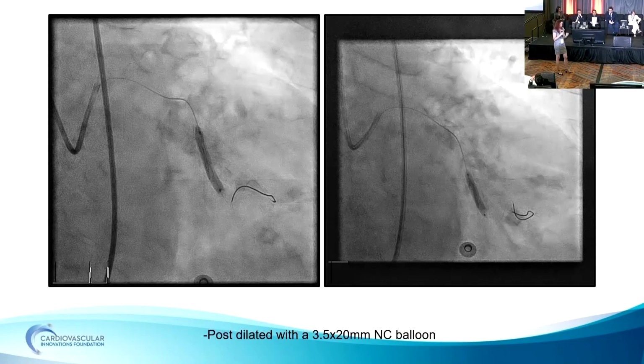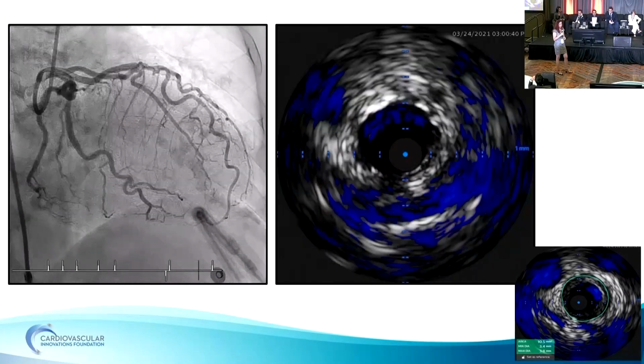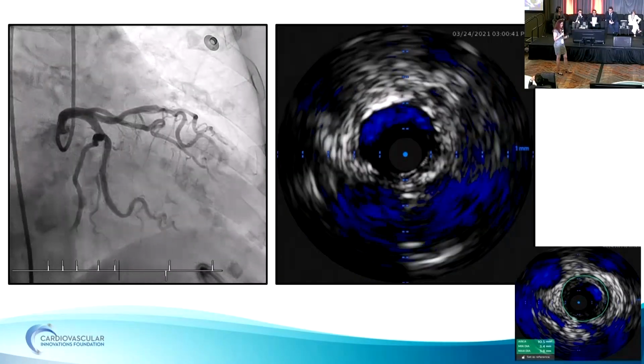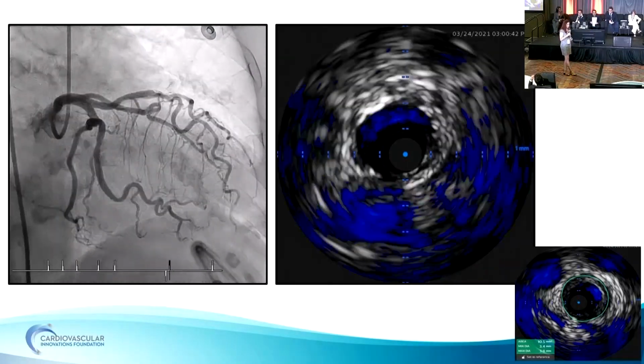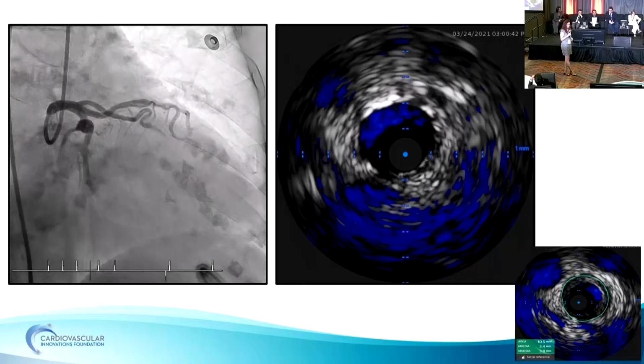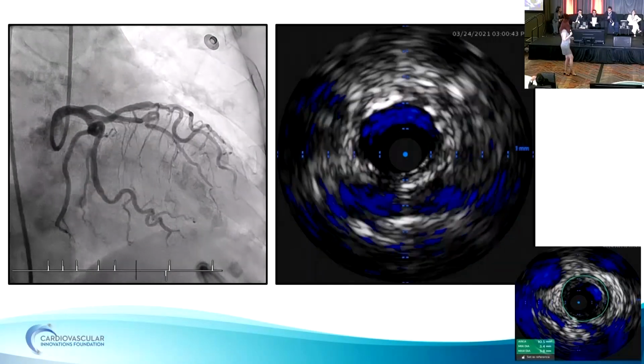You can see that portion of the vessel is diseased. And then this is the final IVUS. I can't drag it, but you can see all the 3 layers, and there was good area. Let me just see if it shows. It's a bit slow. So what happened with the RCA next?